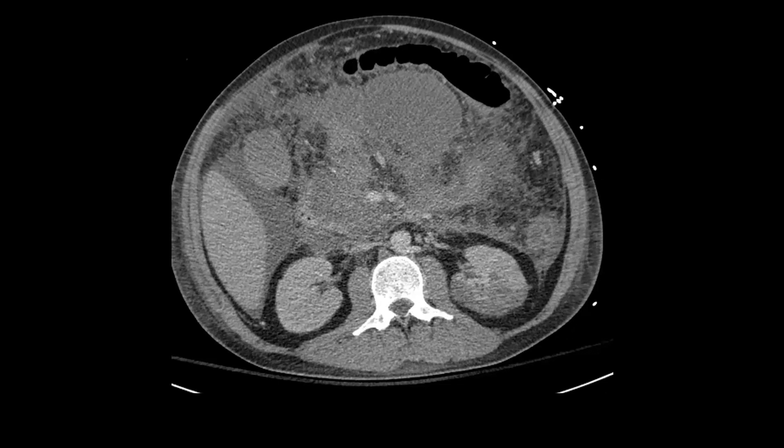And again, there are the renal infarcts on the left. The patient then improved clinically and had a follow-up MRI three months later.